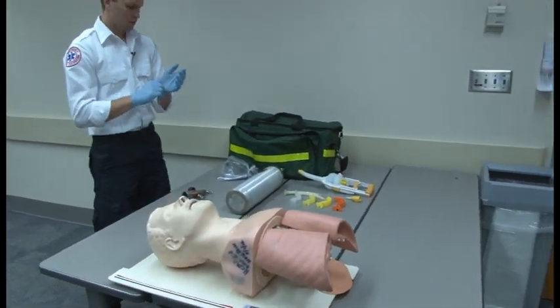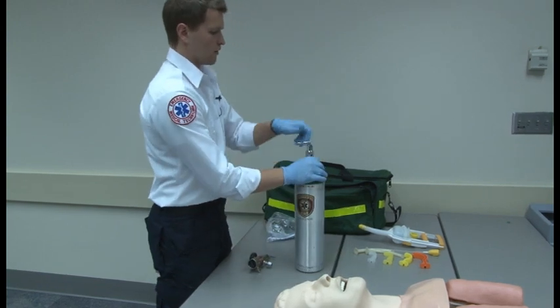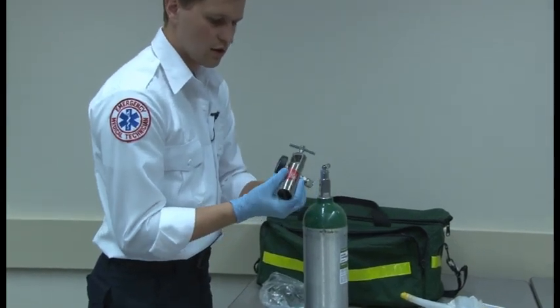First of all, I'm going to BSI, put it on. I'm going to check that I have everything ready and set. Now I'm going to crack the valve. I'm going to assemble my regulator and check that there's an O-ring on there.